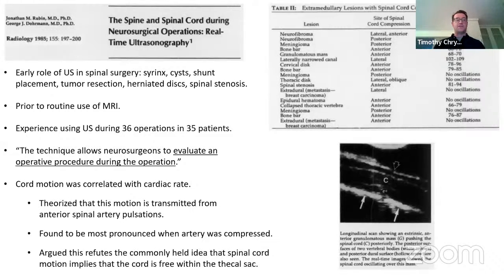That's a very tough question to answer. I don't think we quite know just yet. I think there's a very nice complementary role for both, and I think of ultrasound really as, we do it anyway, but it's really a check if there is a neuromonitoring change. I think that's something that would have to be studied much more closely, but that's a very interesting question. As of now, I don't think I would want to dispense with either.